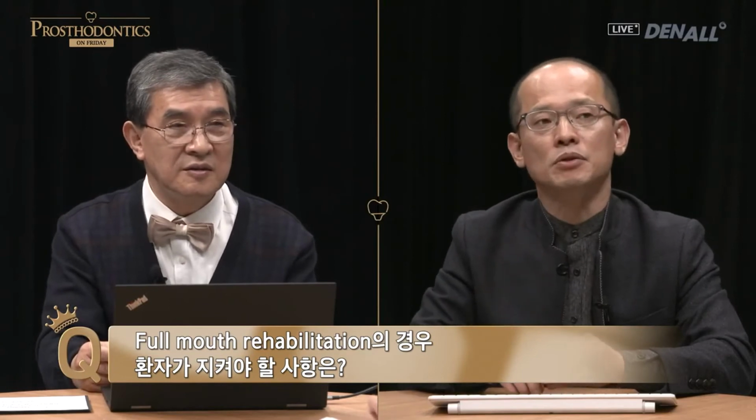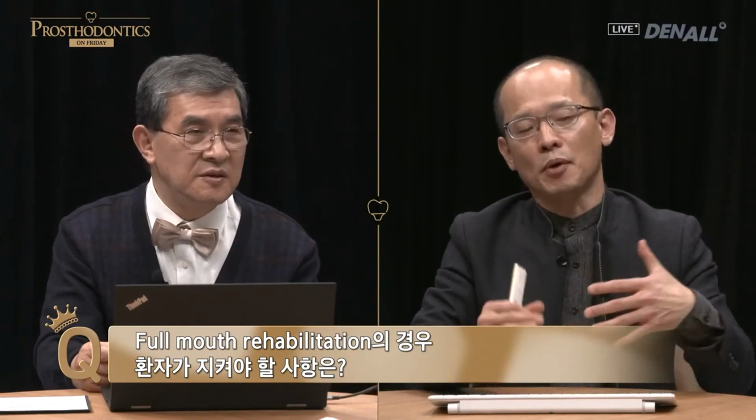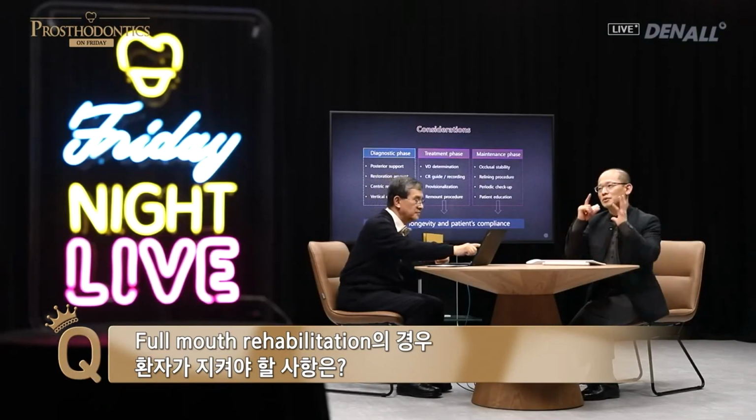Now, as a practitioner, first thing I want to emphasize is that, yes, the margin needs to be correct, the occlusal plane needs to be also adequate, and it needs to be aesthetic. Let's say all this has been solved. Besides that, after setting, occlusal adjustment needs to be not done a lot at the beginning.